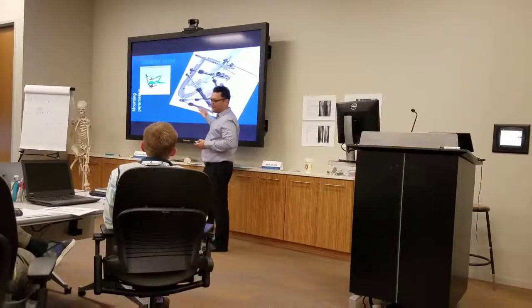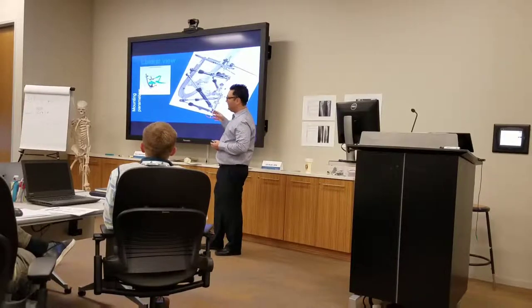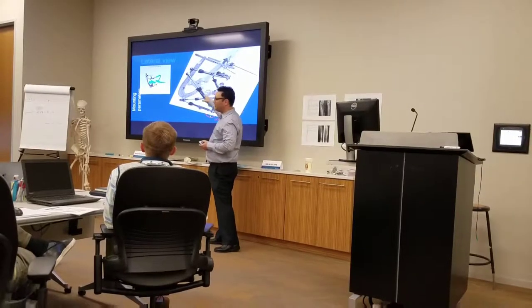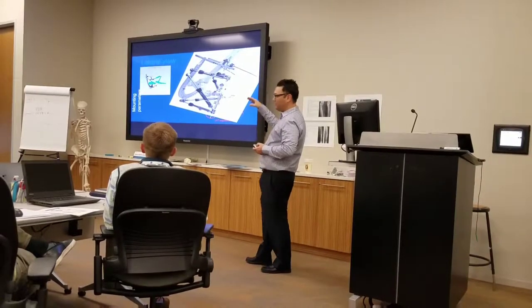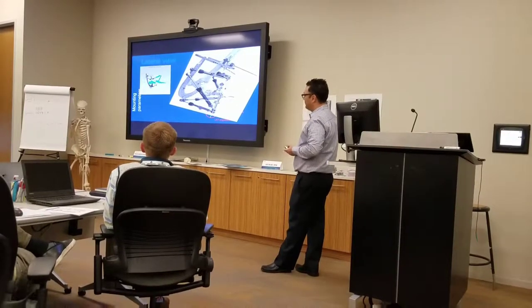So with the new hex system, you can get a much more exact calculation. That's not proper English, but you can get a better calculation because they did all of those formulas to know exactly the place from the bone when you draw that line. And then you're going to have a much better correction with fewer residuals.